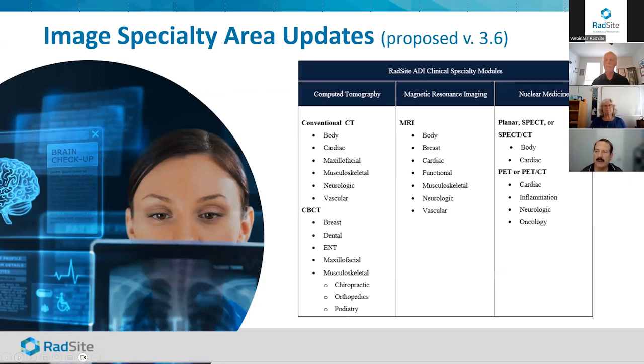So one can compare brand A with brand B with brand C, all along a certain set of parameters related to contrast and resolution and a variety of other quality parameters, including noise, whereas those are not really standardized with cone beam, and to a large extent, they're self-referential in the sense that each vendor has its own set of what the parameters are and even its own phantoms and ways of scanning. And that's a fundamental difference.